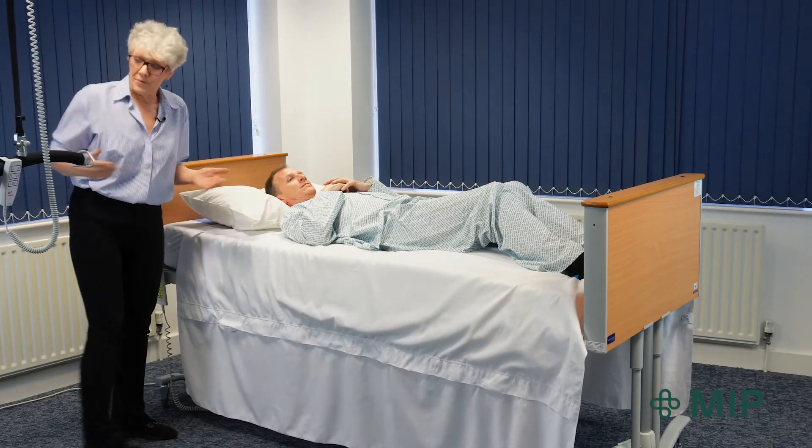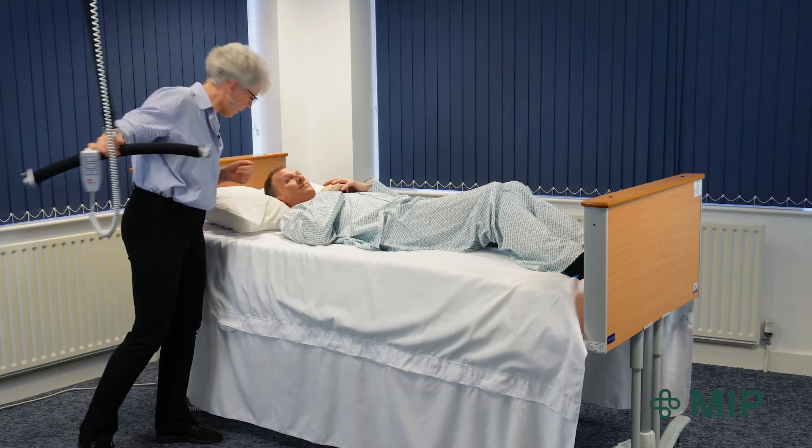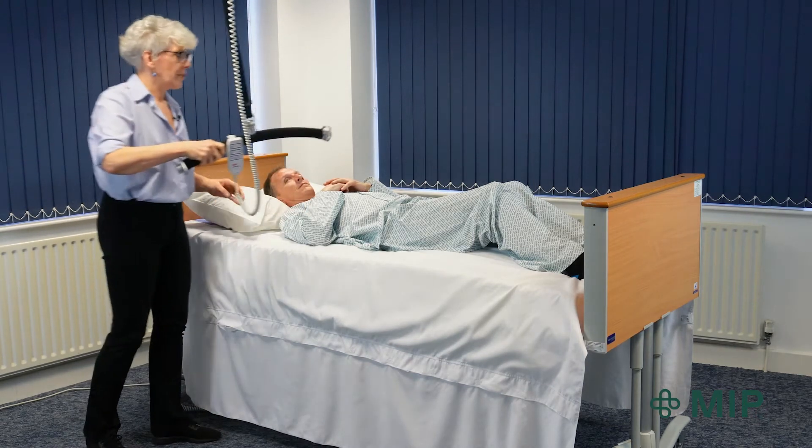I've got the bed up to a nice comfortable height. I've told the person what I'm going to do — move you up the bed — and I'm going to bring the hoist in.